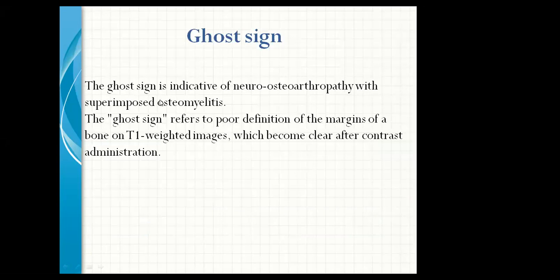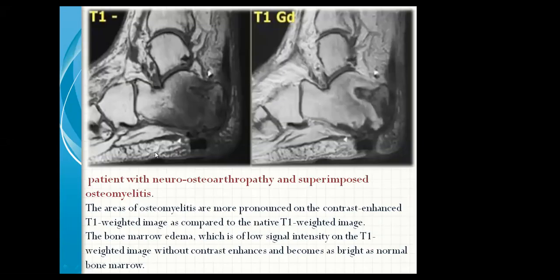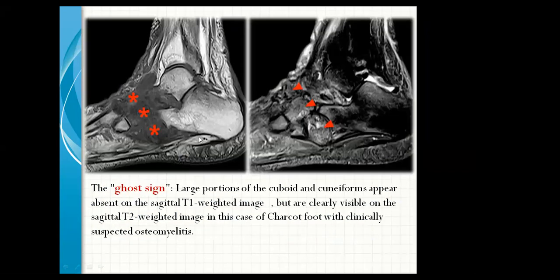Ghost sign. The ghost sign is indicative of neuro-osteoarthropathy with superimposed osteomyelitis. It refers to poor definition of the margin of the bone on T1-weighted image, which becomes clear after contrast administration. In this patient with neuro-osteoarthropathy and superimposed osteomyelitis, the areas of osteomyelitis are more pronounced in the contrast-enhanced T1-weighted image compared to the native T1-weighted image. The bone marrow edema, which is of low signal intensity on T1-weighted image without contrast, becomes as bright as normal bone marrow after enhancement. A large portion of the cuboid and the cuneiform appear absent on sagittal T1-weighted image but are clearly visible on the sagittal T2-weighted image in cases of Charcot foot with clinically suspected osteomyelitis.